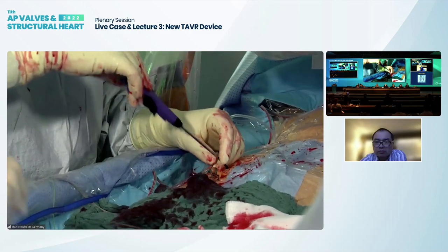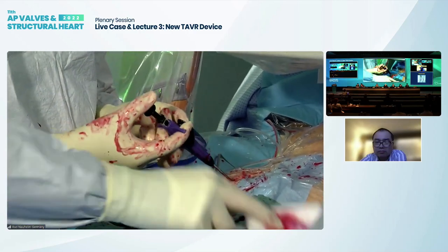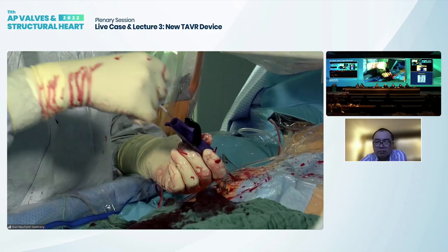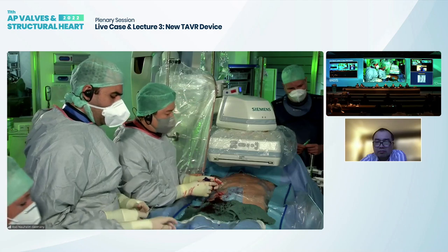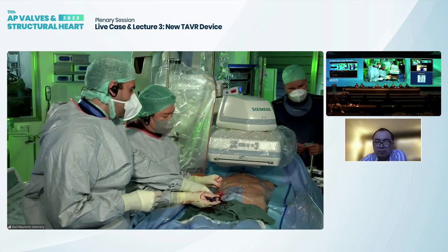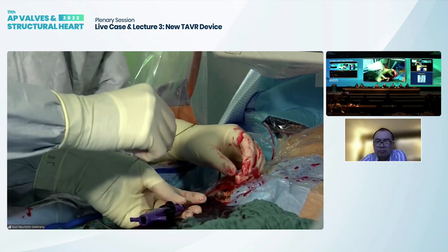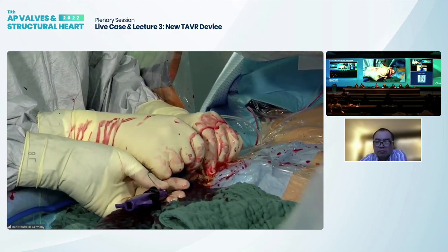We have found that very frequently, I know what is your experience, very frequently the second ProGlide, especially if we do it the old way and insert it at 10 and 2 o'clock, the second knot was not effective. Mm-hmm. I don't know. I think that putting one ProGlide at 12 o'clock makes it much more effective.